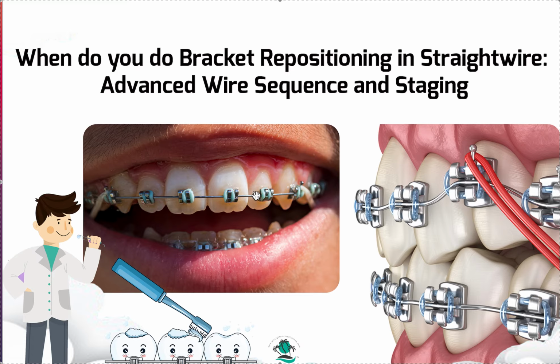Obviously, I just kind of picked some of these photos because you can see here that 8 and 9 don't look symmetrical. That's the first thing I'm going to look at. Do things look symmetrical? I like to see mirroring. Does this look like this? Does this look like this? Does this look like this? I'm also going to check the bite and everything like that too.